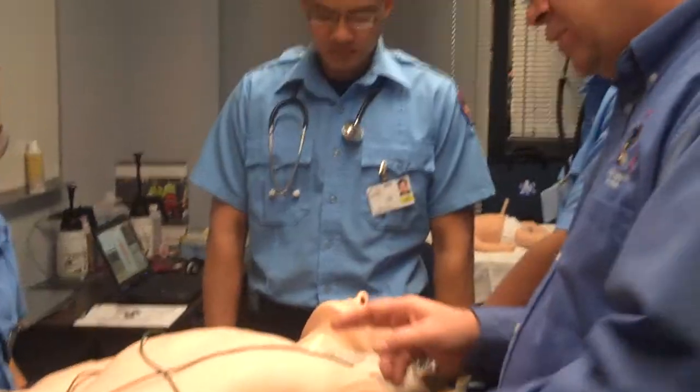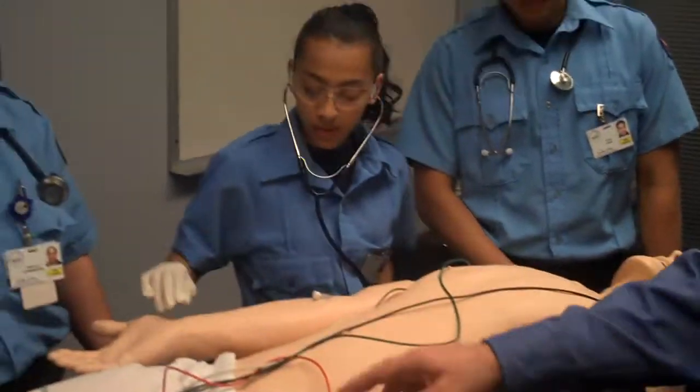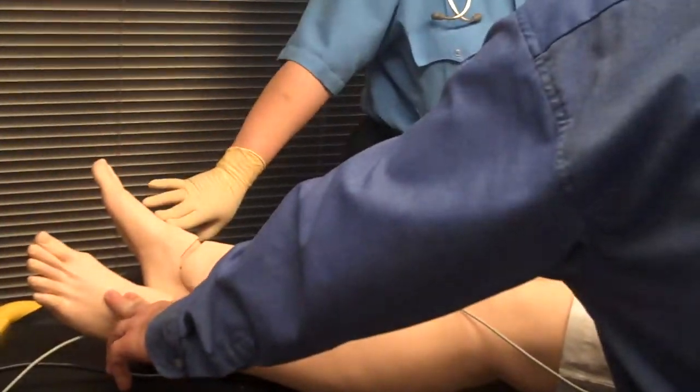Monitor cables for the advanced providers, but you've got pulses all over that you can actually feel. There's a lady here. It's a carotid, radial, femoral, and also dorsalis pedis on the foot that you can feel.